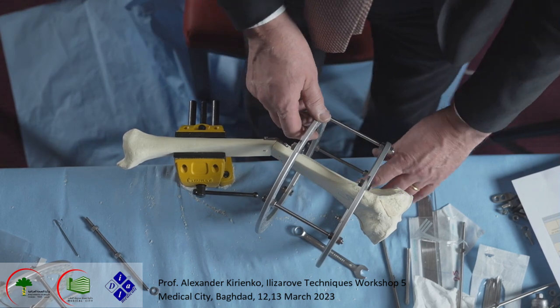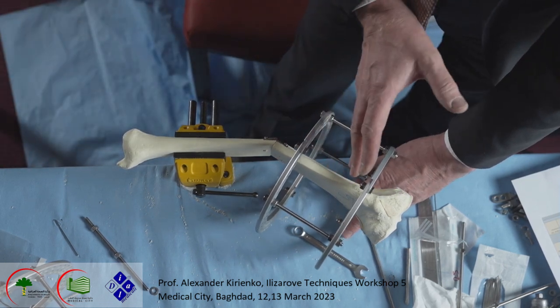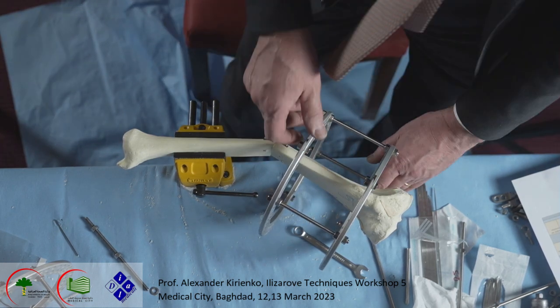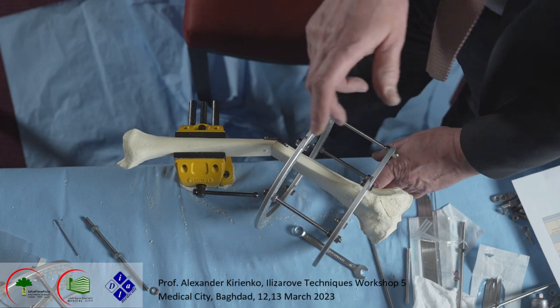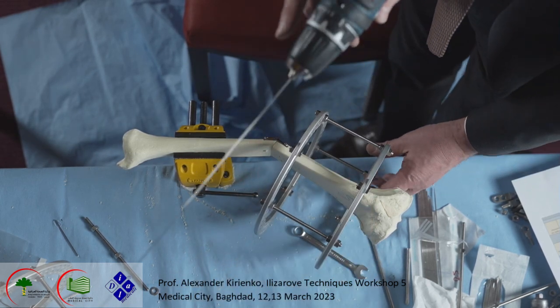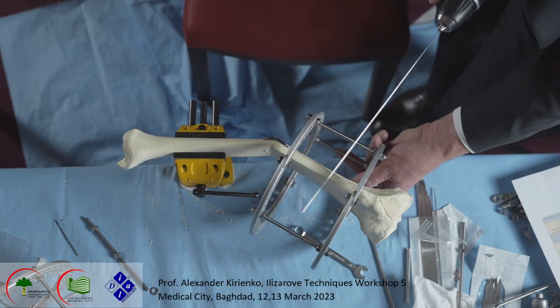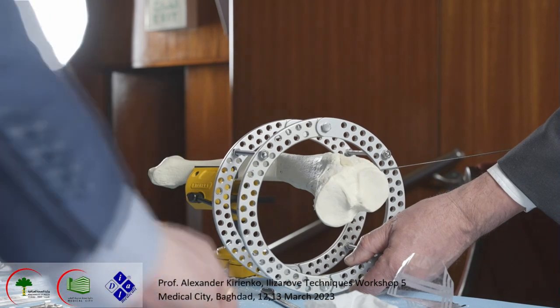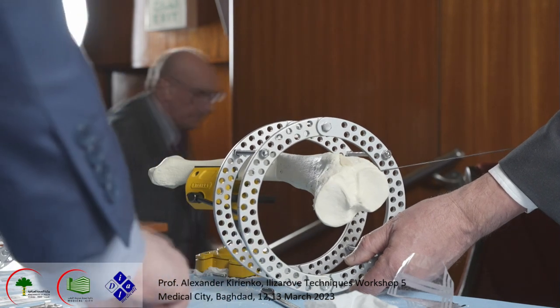Okay. What I do, I put this proximal system perpendicular to the tibia. We put the wire now. Keep it here, like this.